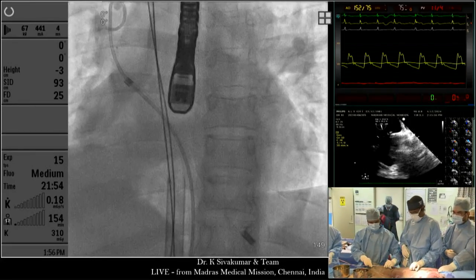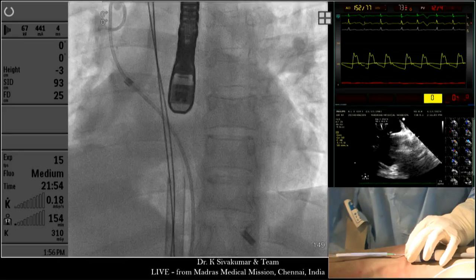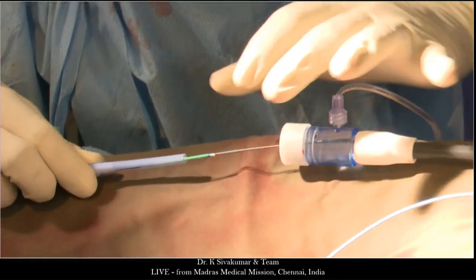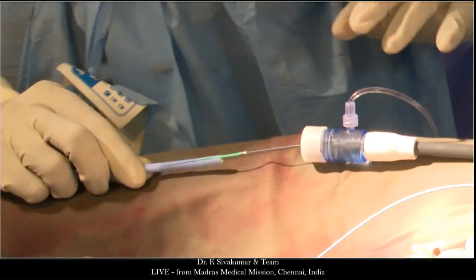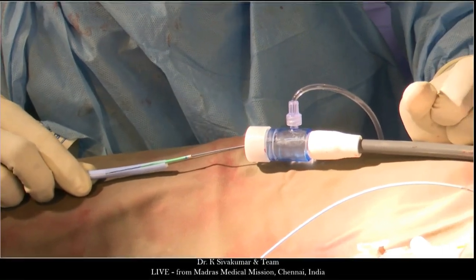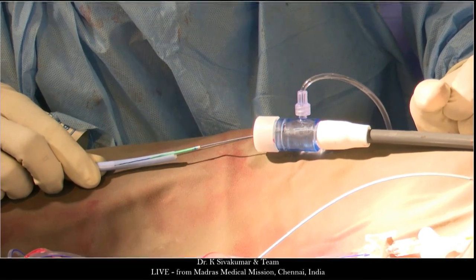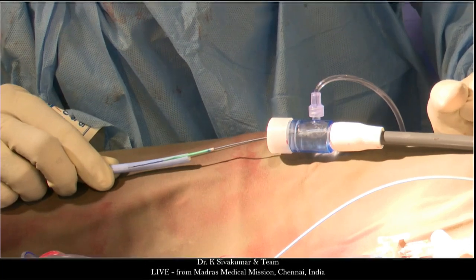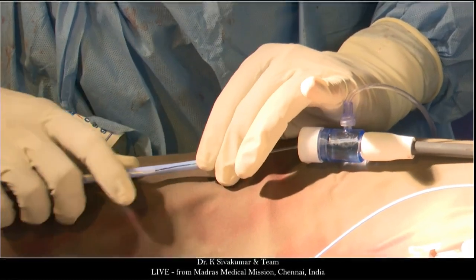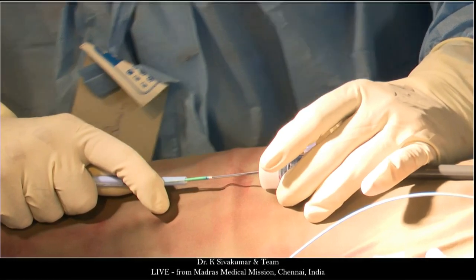Hopefully this case, and the case that Ahmed and I will do on Friday or Saturday, will teach some of you the transcatheter technique, tips and tricks to start a program. Recently Dr. Eric Rosenthal made a world registry, and now he has included close to 380 patients, so the world experience is slowly increasing. We contributed about 135 patients in that cohort of 380 odd patients. And obviously you have the largest experience in London, and in our center in Doha.